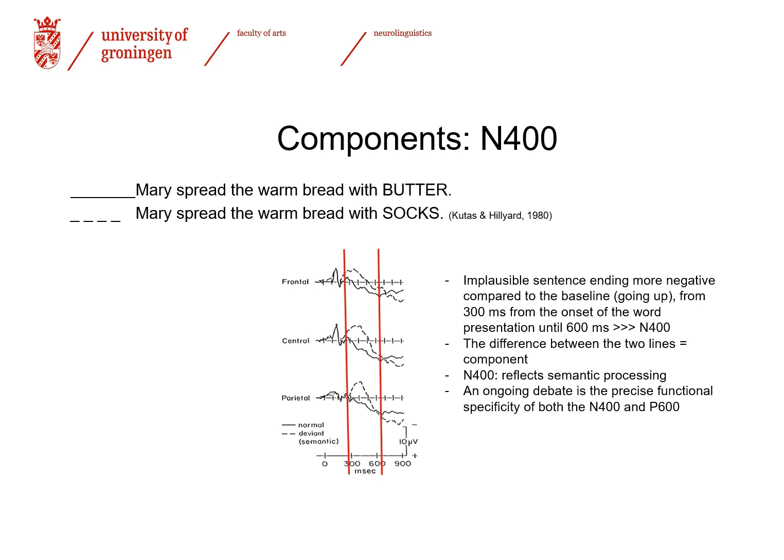This regularity in the signal, which is something that we can observe in almost any semantically related experiment, is called a component. And the particular component that we see here is the N400. N for negative and 400 for simply peaking at 400 milliseconds. So this is what a component is. And mind you, this is a very liberal definition, so I'm just doing it for the sake of making things clearer for you guys.